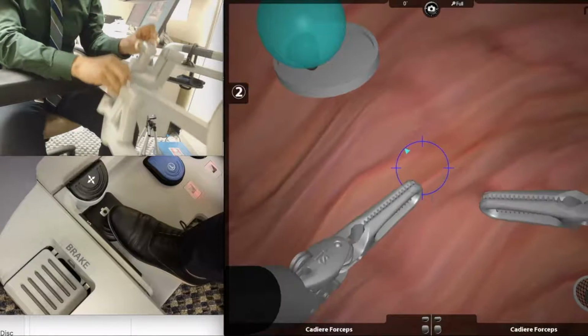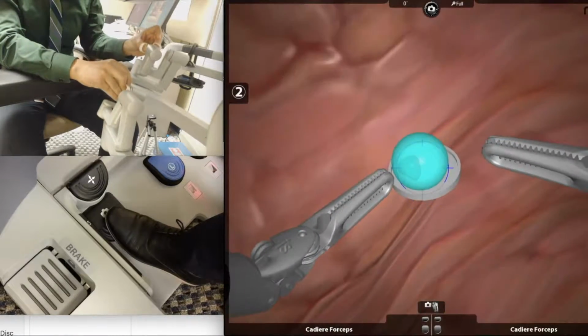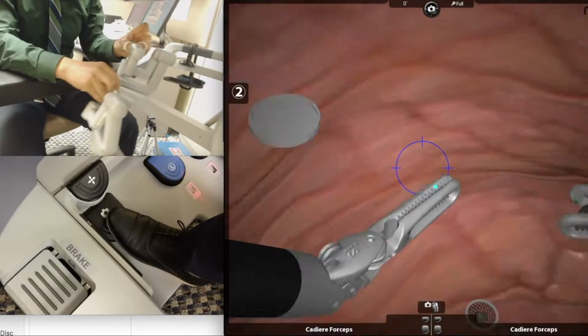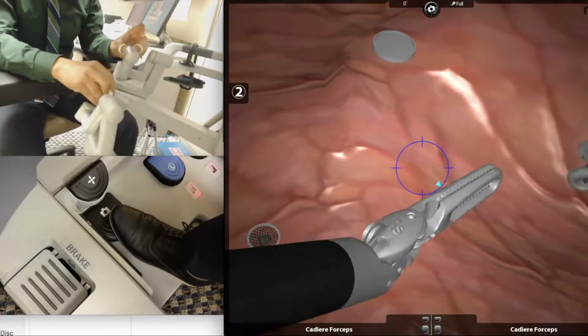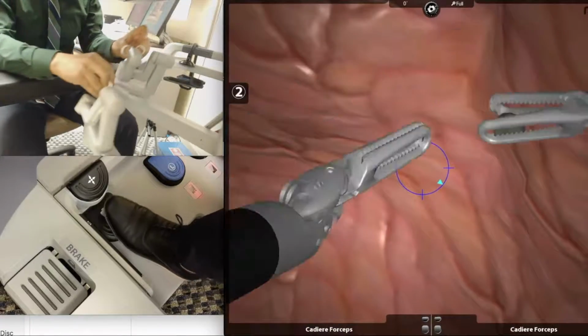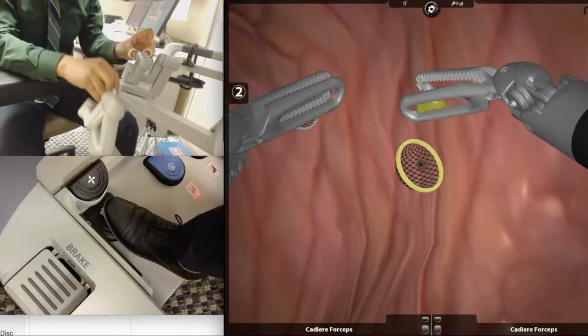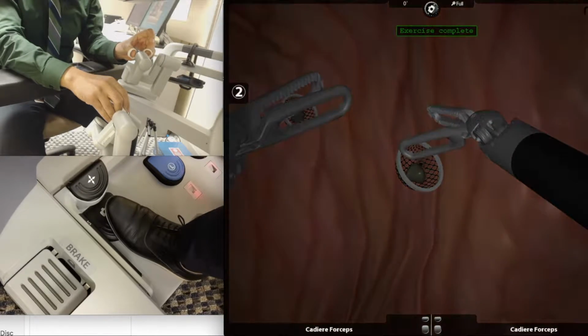One of the most useful tips in this task, especially when traveling for long distances, is to keep both arms as close together as possible and move them as one unit. This avoids excessive rotation while minimizing the chance of losing the object from your grasper prior to reaching the basket.